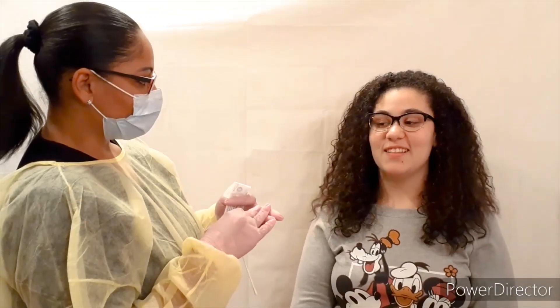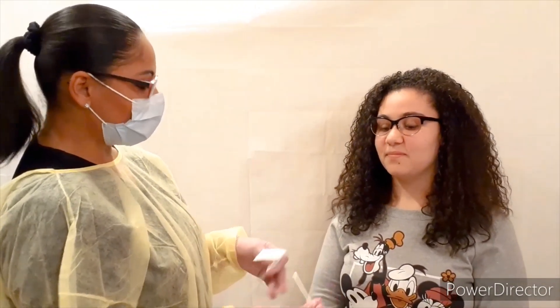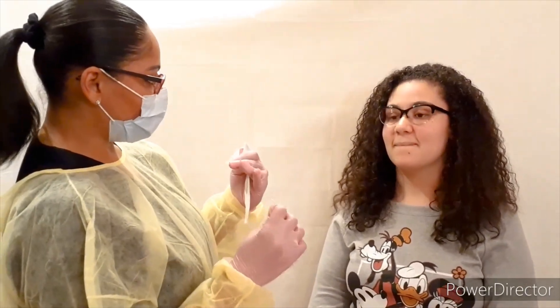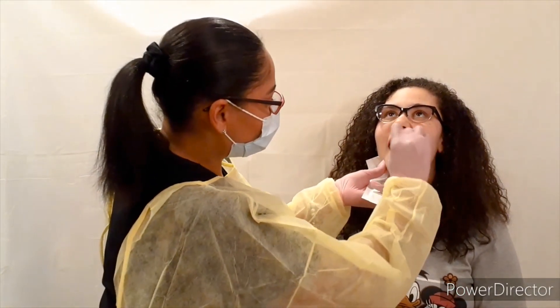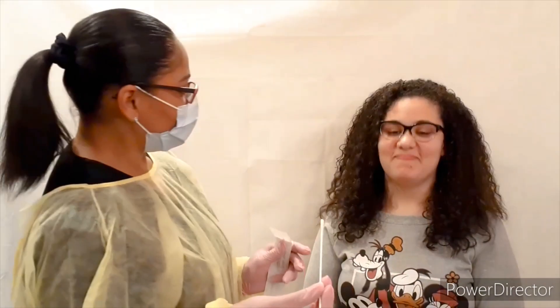Can you give me your name and date of birth, please? Alexandria Wilson, 8/30/2001. My name is Minnie, and I'm going to do a quick strep test for you. If you happen to gag, just try your best to relax the back of your throat, and I'll get this over with as soon as possible. If you'll stick out your tongue for me, I'll go over to the right and twist, and then again to the left and twist, and we're all done. So now I'll take this to the lab and we'll run it for analysis to let the patient know whether or not they are positive or negative for strep.